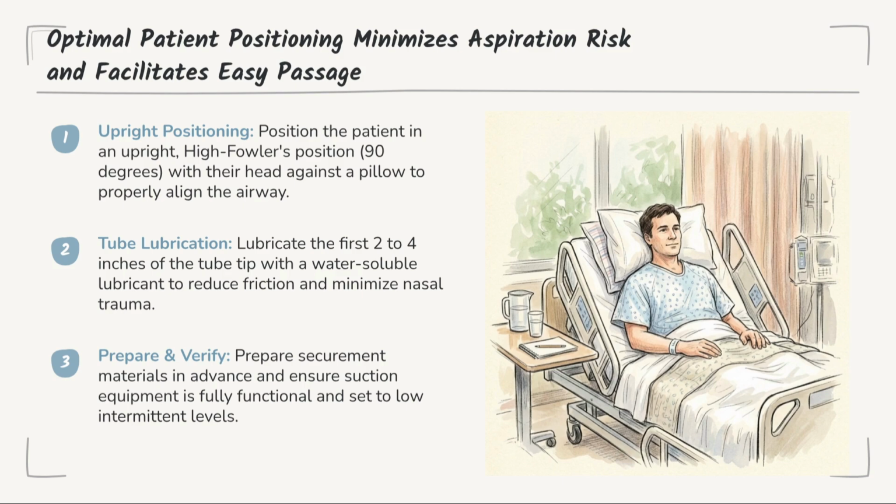Proper positioning facilitates easier passage and reduces aspiration risk. Place the patient in a High-Fowler's position at 90 degrees with their head supported. Lubricate the tube tip to minimize trauma and ensure all your equipment, including suction, is ready and functional.